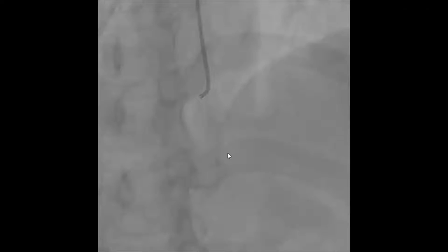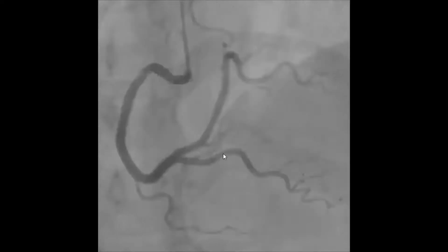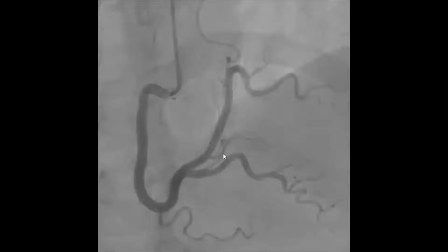Now, what do you see here? I'll just pause for a second. So what do you see here? Again, this is our catheter. And again, it's in the left upper part of the screen, and it's injecting to the right coronary artery, which is assuming this course. But what you see here is the bifurcations become much clearer. So you can see the PLV branch going this way, and the PDA, the right posterior descending artery, going this way. And also, if you look at the diaphragm earlier on, we could only see the diaphragm occupying less than half of the screen.